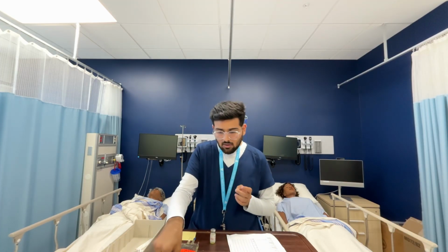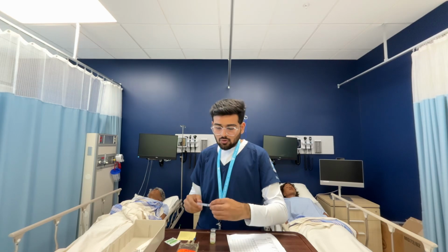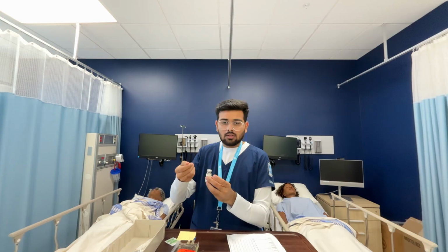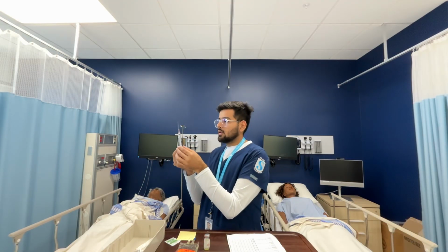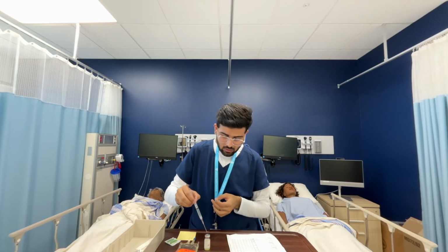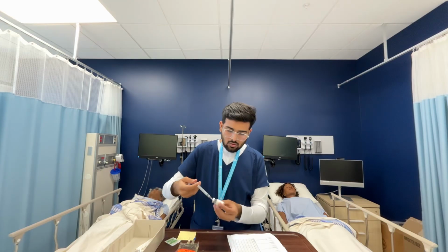On my second check, now I'm going to use my blunt needle. I'm going to use a brand new one, and I'm going to open it. I have a 3 ml syringe because I have to draw 2 ml. So I'm going to open my vial. This is brand new. If it's not, I'm going to alcohol swab it, let it dry for a bit, and then I'm going to draw 2 ml of air, and I'm going to inject that into the medication.